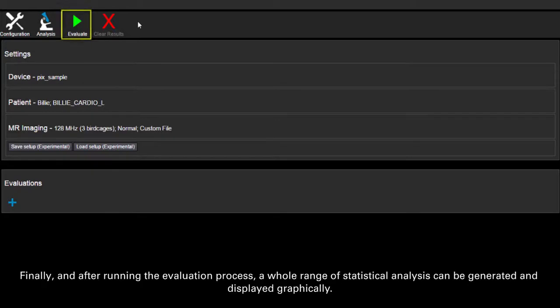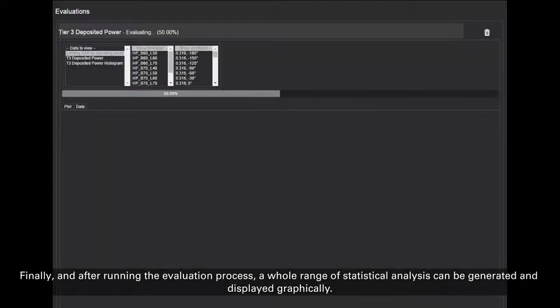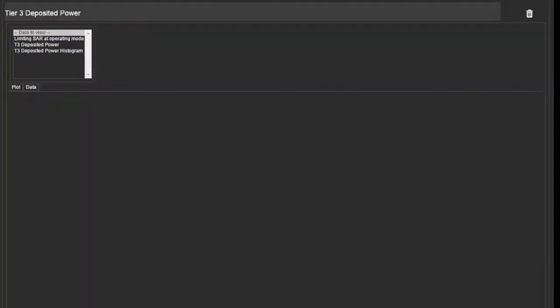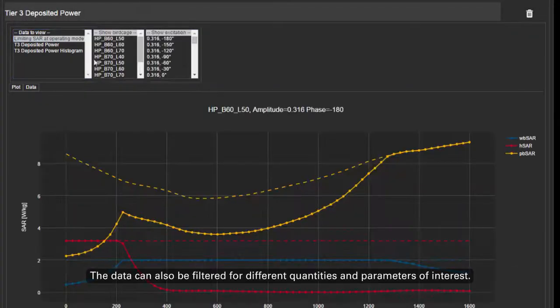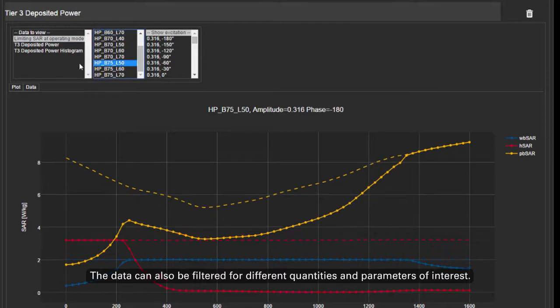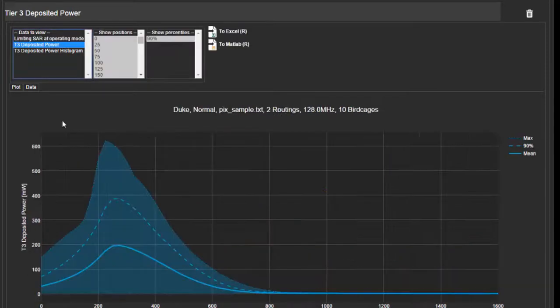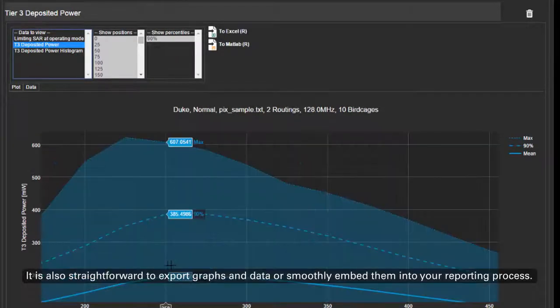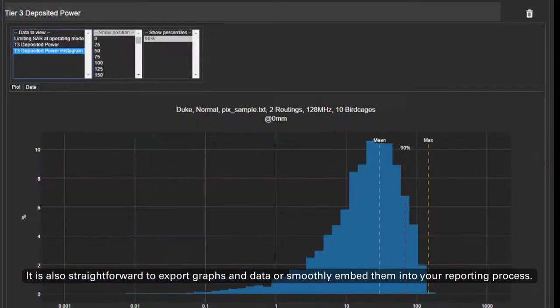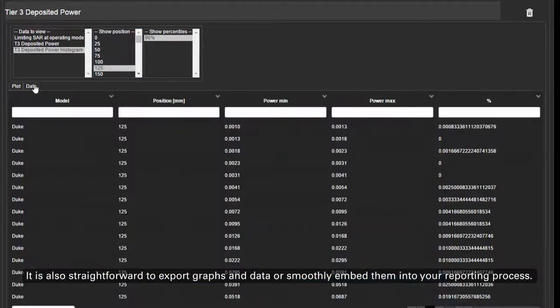Finally, and after running the evaluation process, a whole range of statistical analysis can be generated and displayed graphically. The data can also be filtered for different quantities and parameters of interest. It is also straightforward to export graphs and data or smoothly embed them into your reporting process.